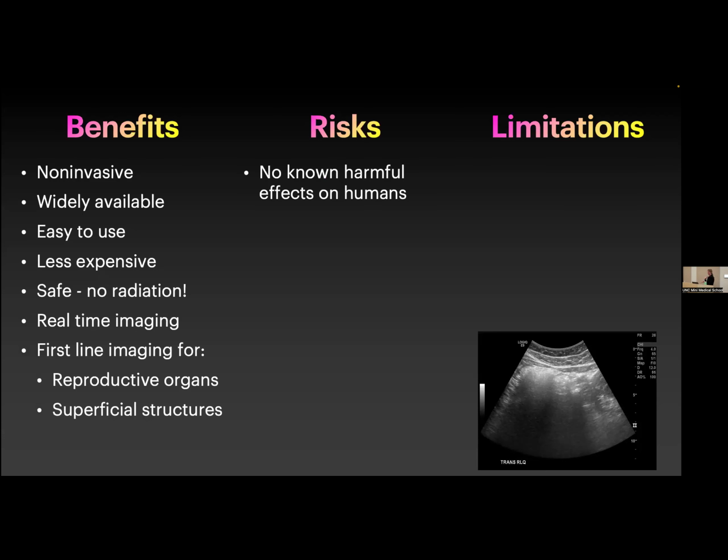What are the risks? Well, there's not really much in terms of risk. There are no documented known harmful effects on humans. The only thing I mentioned here is particularly in pregnant patients, there is a theoretical risk of heating associated with the ultrasound. It's something that we call a thermal index, and we've known about this for a long time. The way that ultrasounds are performed in pregnant patients, the thermal index never reaches any level that has ever been associated with poor outcomes. So that would be the only potential risk I would mention with ultrasound, in that very specific patient population.